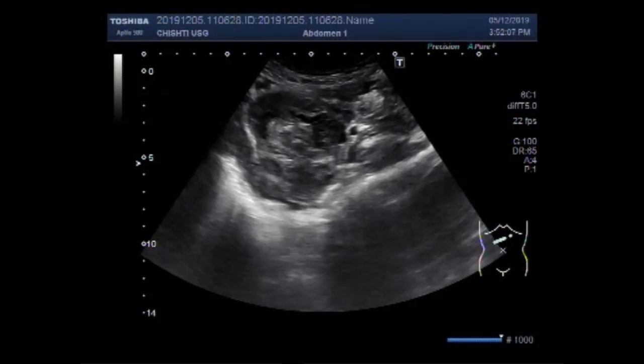Dear viewers, I hope you are all fine. This ultrasound video shows a complex ovarian mass.